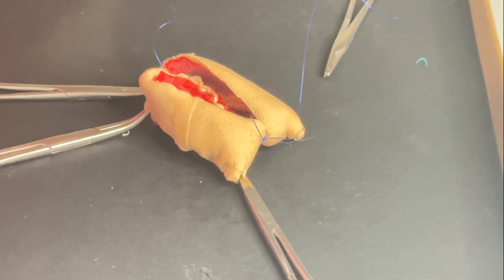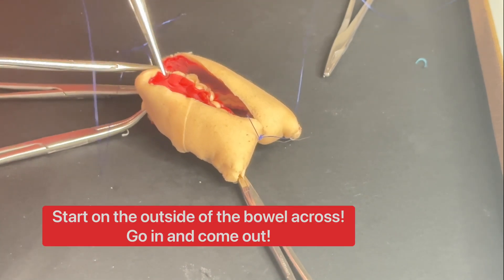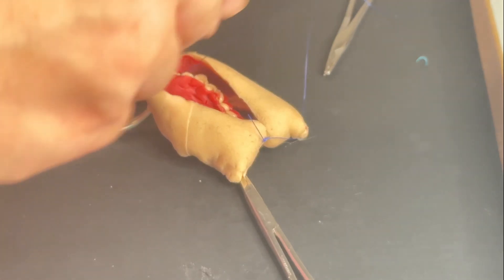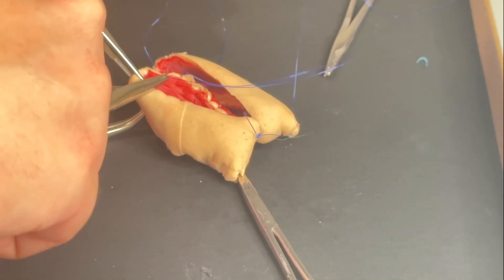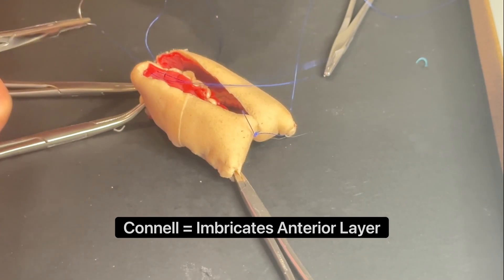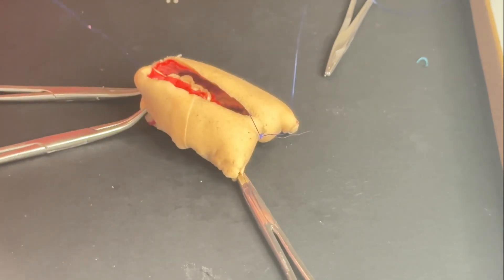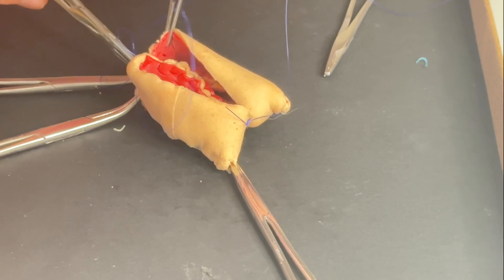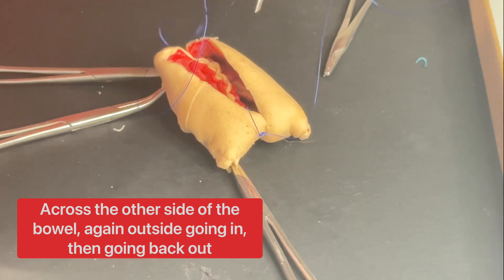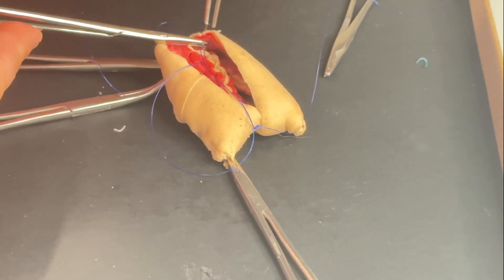Now that you have transitioned outward to do your Connell, you take a couple of bites — start from the outside, cross to the other side, still taking equidistant bites, then move back inward and back outside. What this does is it actually imbricates the anterior layer. Because remember, you were suturing from the inside for the posterior — that's why it's imbricated that way. Using this technique, it actually makes it easier to allow the mucosa to imbricate.